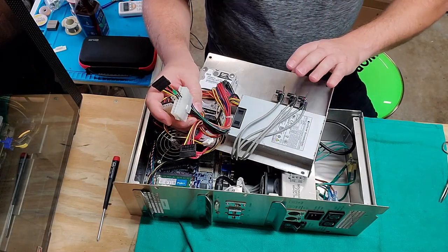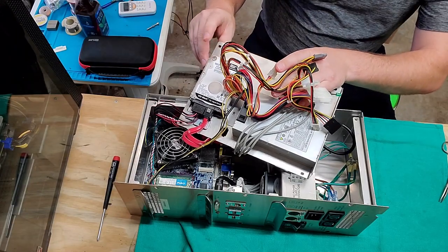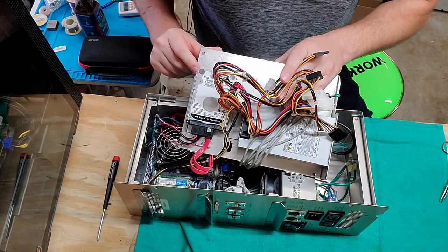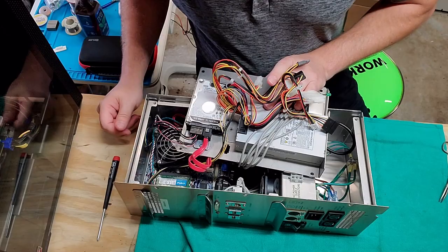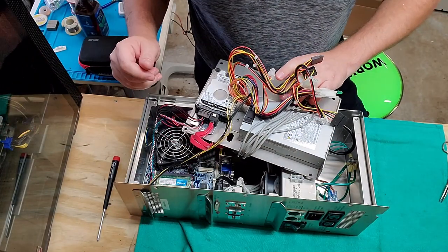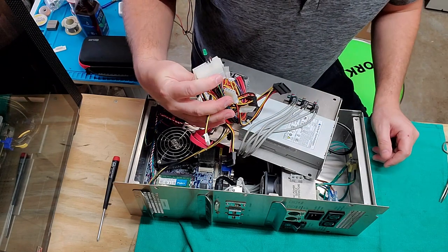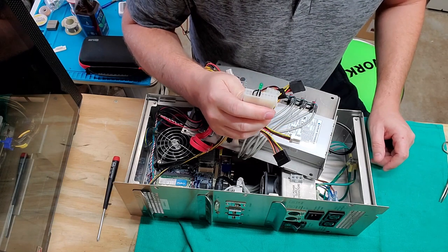Here's those USB ports that were from the side. And I have two 500 gigabyte hard drives, and I would assume, because they use two of them, it's probably going to be like a RAID 1. So let's go ahead and check some of the stuff out. Oh, well, that's interesting. You guys see what's going on here?